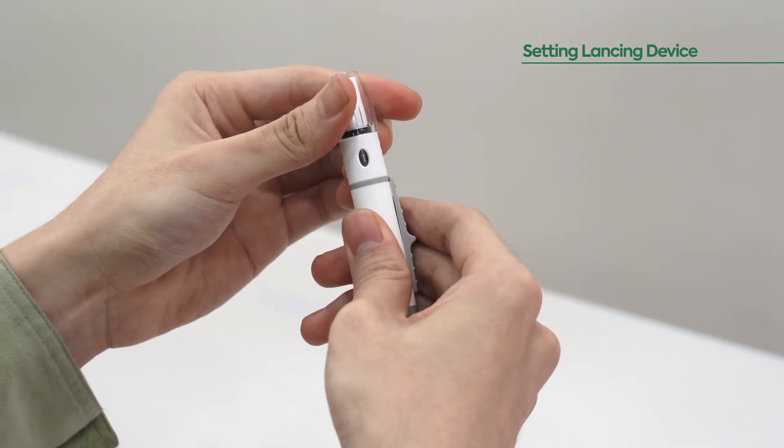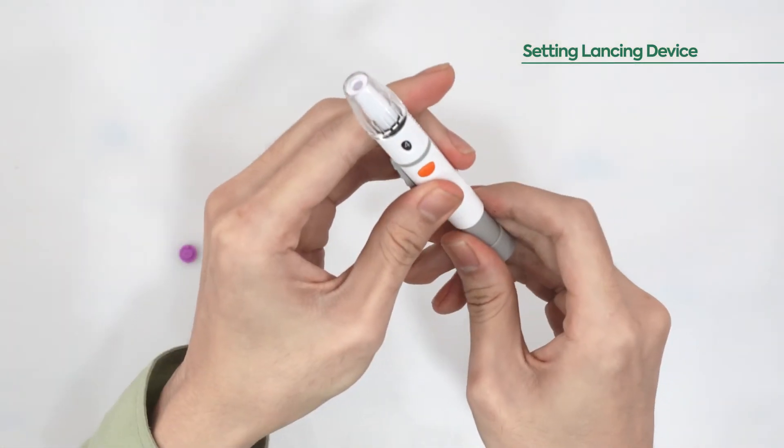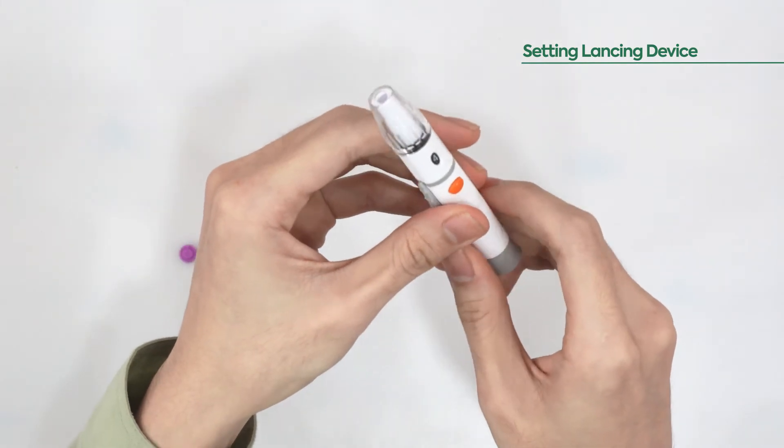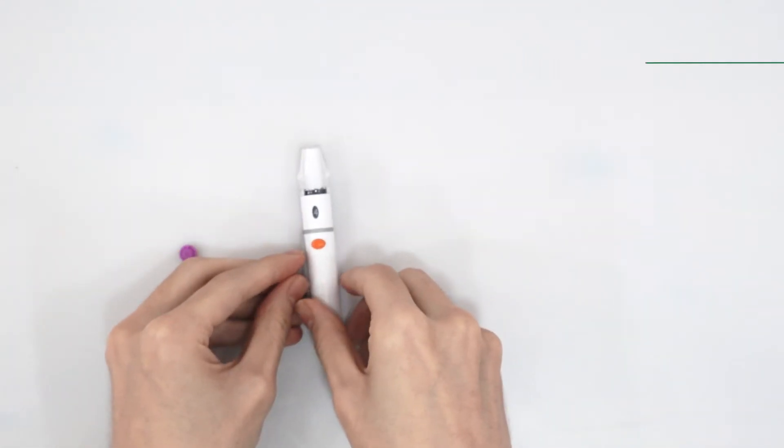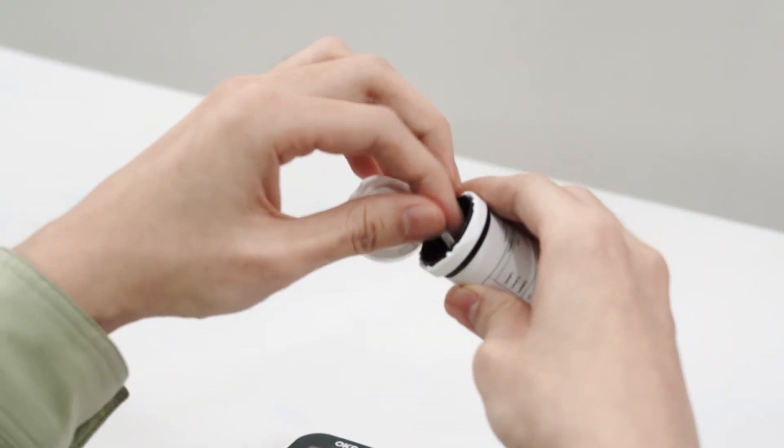Begin on the shallowest setting and increase the dial if more depth is needed. Finally, pull the end of the lancing device until you hear a click. You are now ready to perform a blood glucose test.